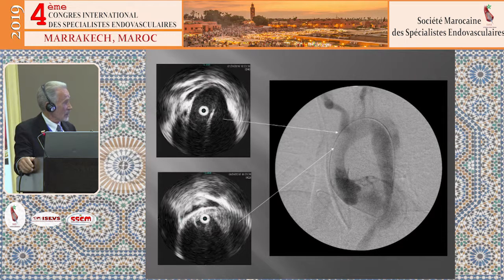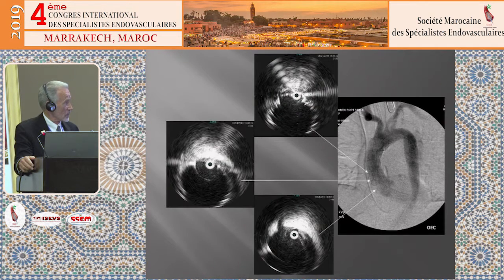This is confirming that we can see in the head vessels that it translates up to the head, and we're not going to put a device in there and then not have circulation to the cerebral area. After the deployment of the device, this is at the coronaries, and then directly above that you can see expansion. Here's the corresponding angiogram with flow to the head.